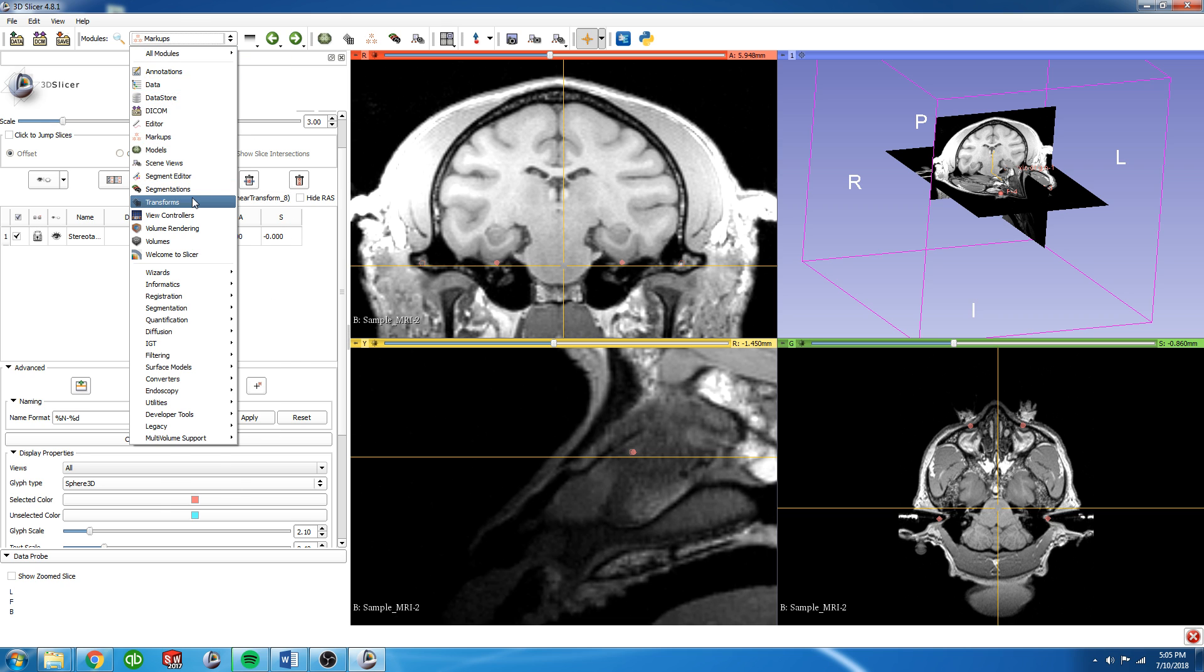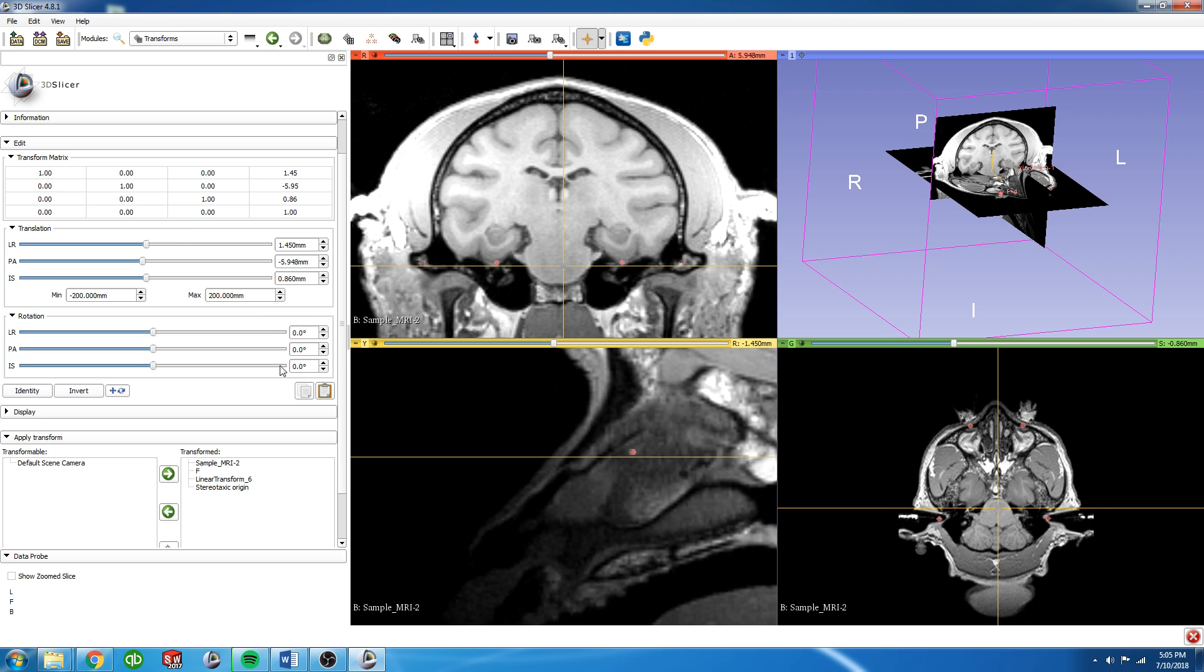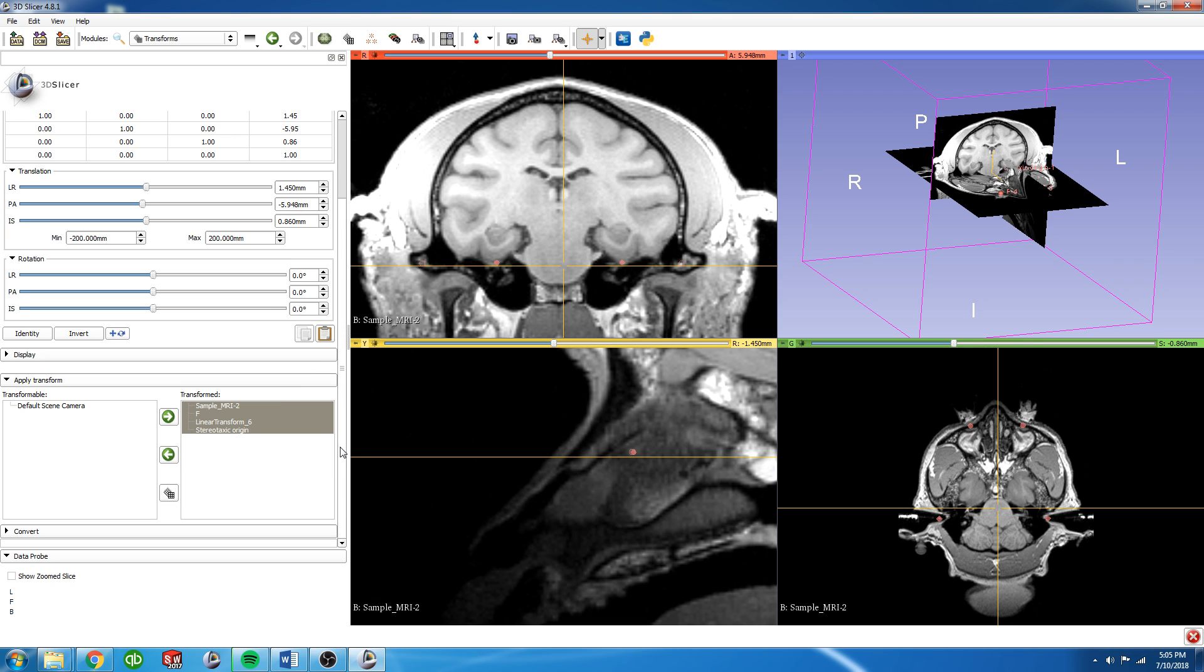So we can go back to the Transforms module. We can highlight all these guys that are being transformed by this new one we've just created and harden that. And it will lock all that in place.